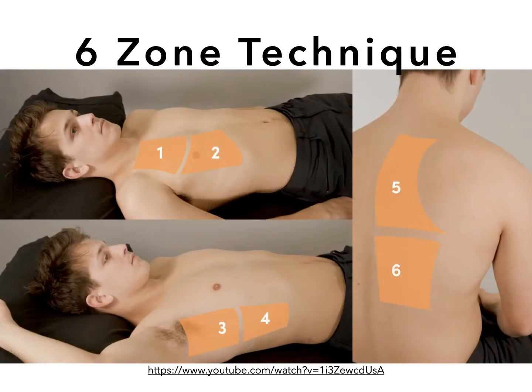However, when it comes to scanning for pneumonia, and COVID specifically, you want to interrogate as much of the chest as possible. Our ultrasound scan is a 2-dimensional representation of a 3-dimensional structure, so we want to cover as much of the lung as we can. I would recommend using a 6-zone technique for each hemithorax, or 12 zones in total. We're going to use the anterior axillary line in white and the posterior axillary line in blue as our landmarks. These lines will divide the chest into the anterior, lateral, and posterior areas. Each area is subsequently divided into an upper and lower zone. So anteriorly, we have zones 1 and 2, laterally we have zones 3 and 4, and posteriorly we have zones 5 and 6.